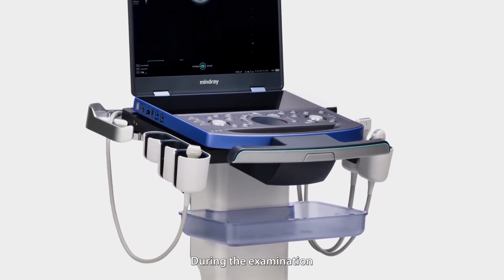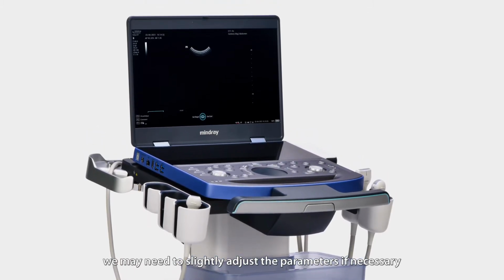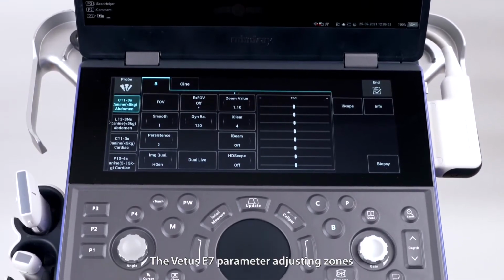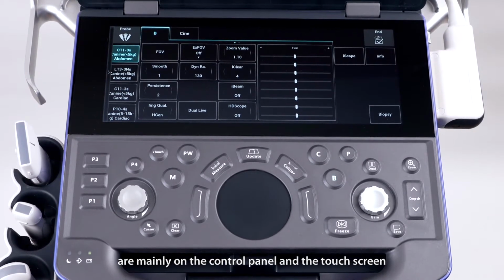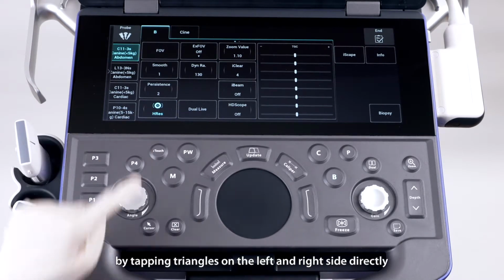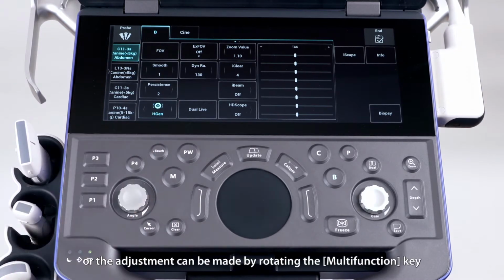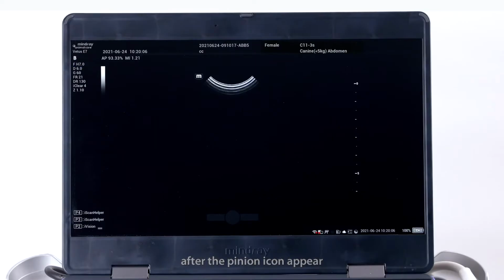During the examination, we may need to slightly adjust the parameters if necessary. The Vetus E7 parameter adjusting zones are mainly on the control panel and the touchscreen. The parameters can be adjusted by tapping triangles on the left and right side directly, or the adjustment can be made by rotating the multifunction key after the pinion icon appears.